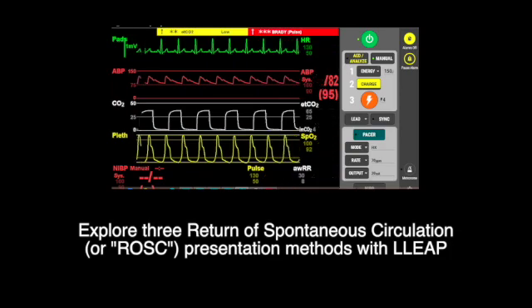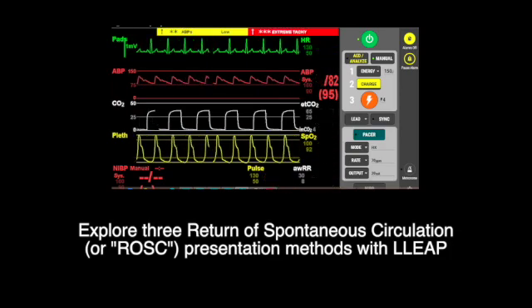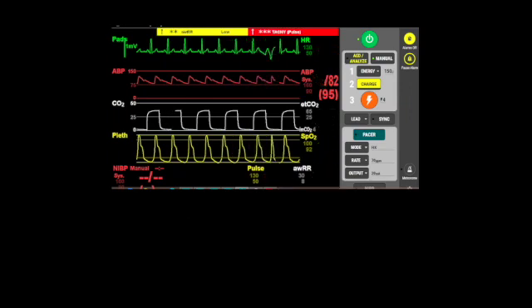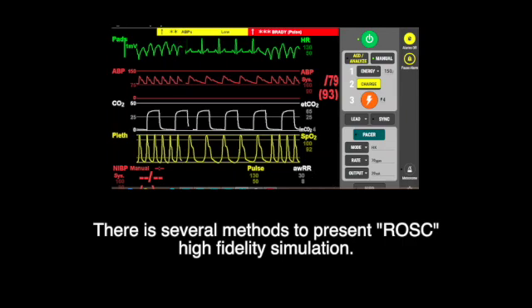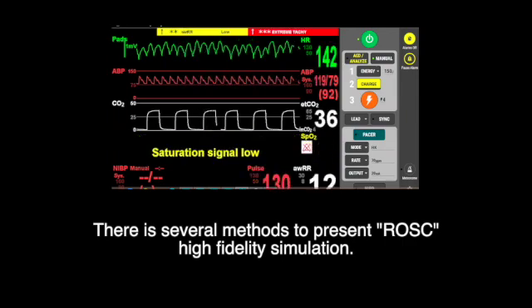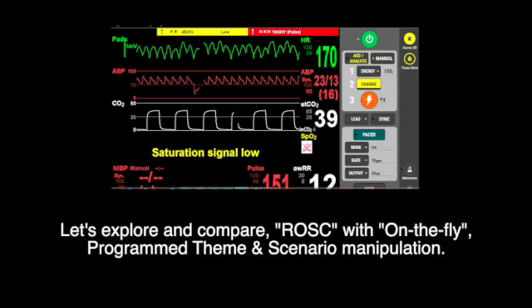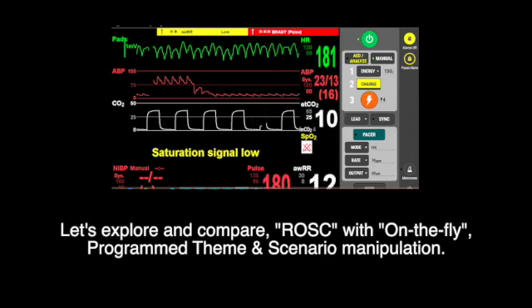Explore 3 Return of Spontaneous Circulation presentation methods with LLEAP. There are several methods to present ROSC in high-fidelity simulation. Let's explore and compare ROSC with on-the-fly Programmed Theme and scenario manipulation.